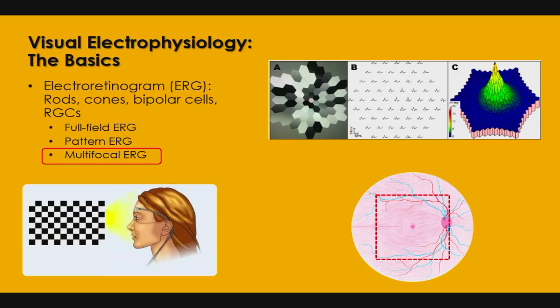So if you think about it, let's call this side A, this side B, and that side C. Ignore everything else. So when this side comes on, and assume every other part of the retina is off, whatever signal is produced, the computer registers it to this part. Then this side will go off and another part will come on, and the computer registers that signal to that part.